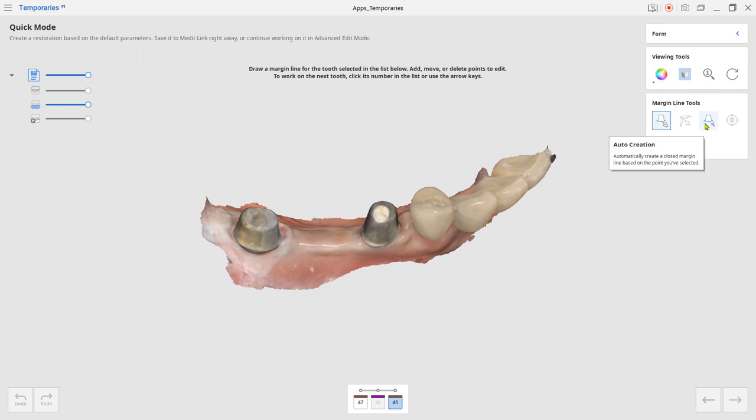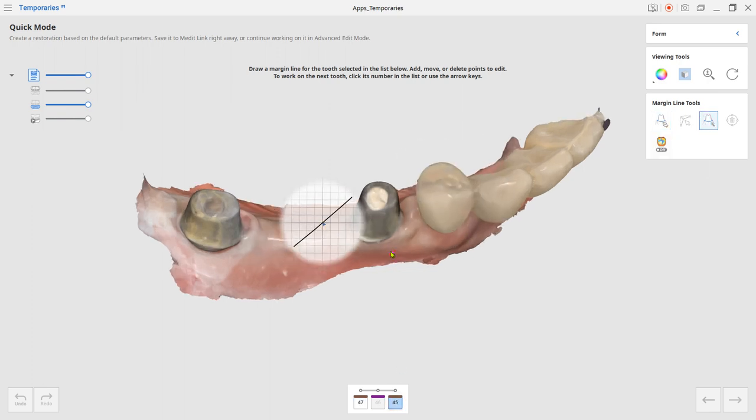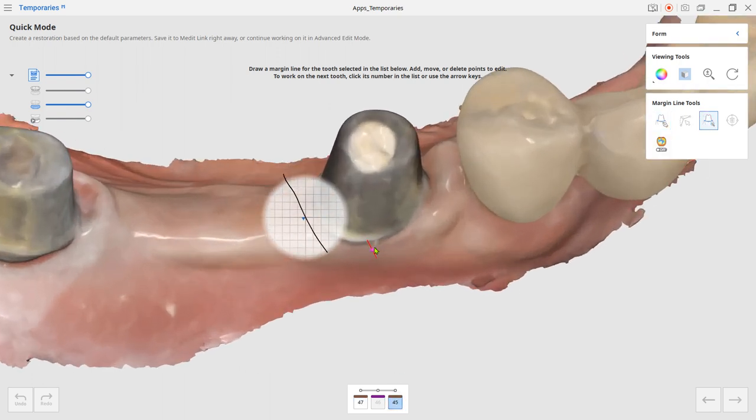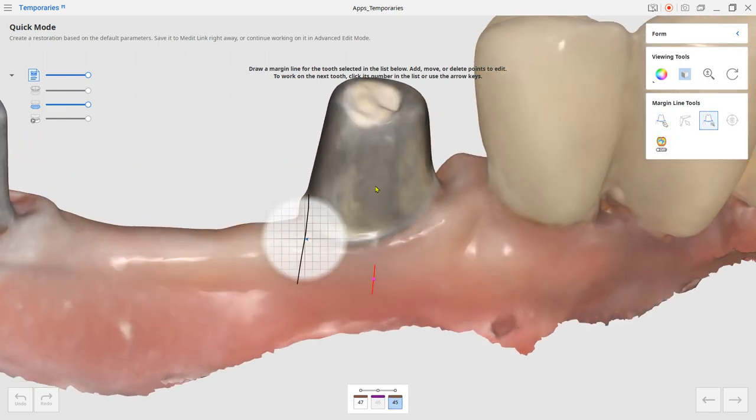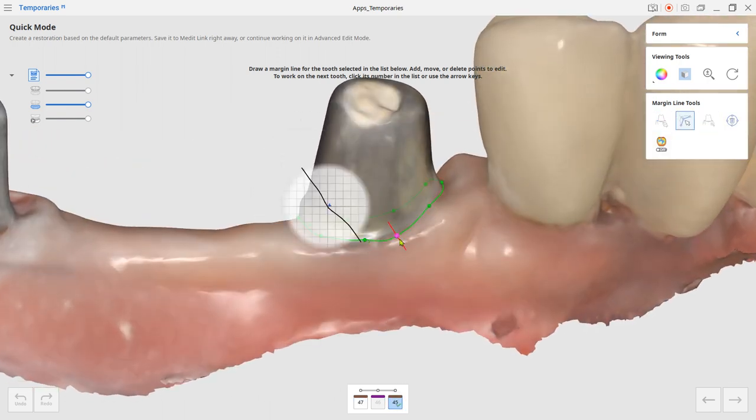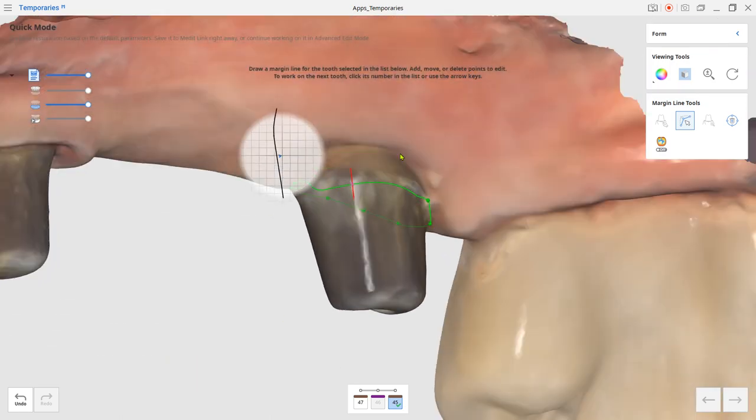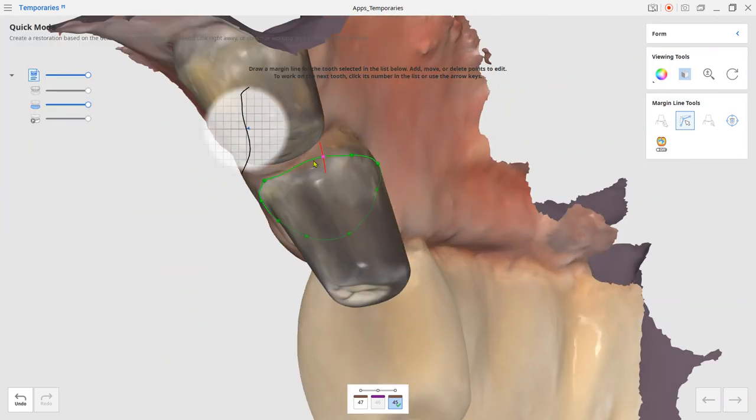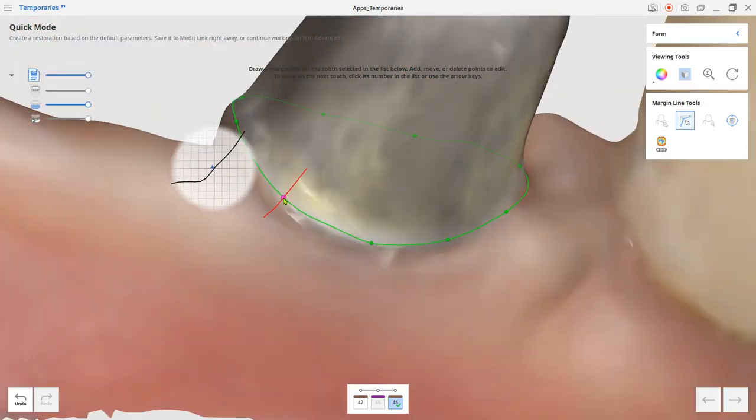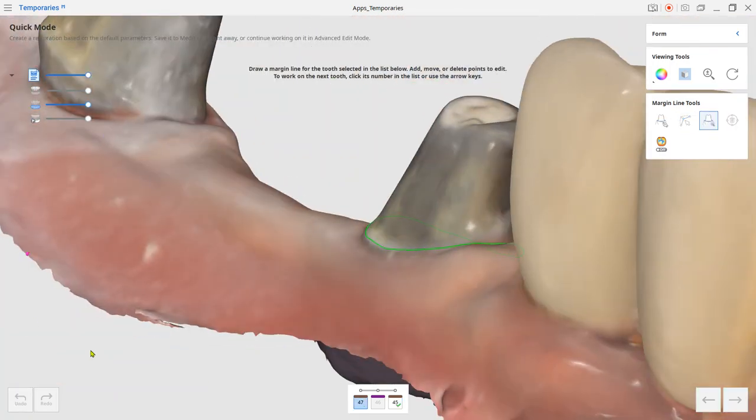Use the auto-creation tool to draw the margin. For the tooth selection, you can use the arrow keys instead of a mouse click.